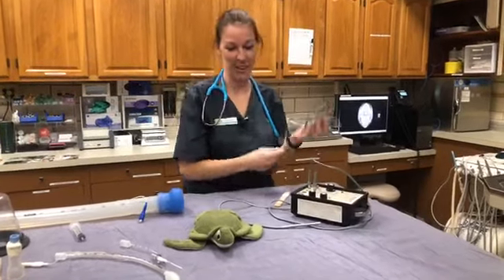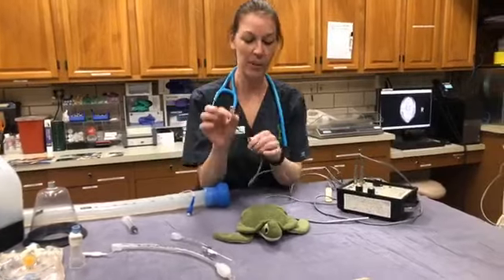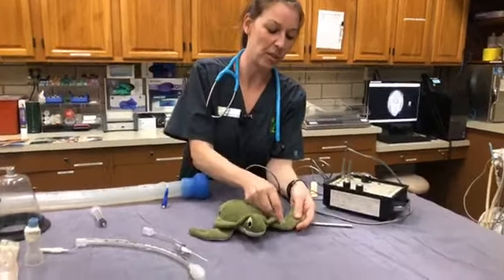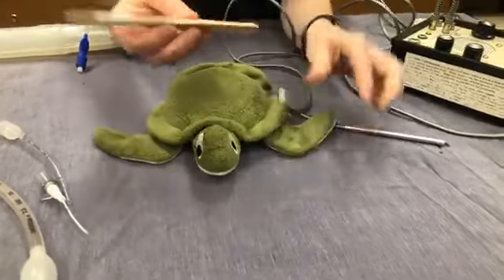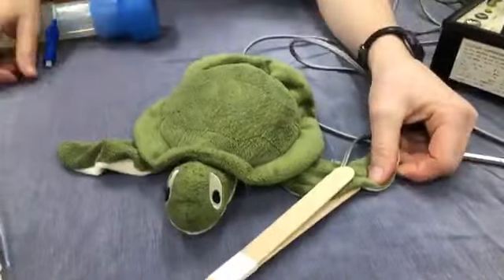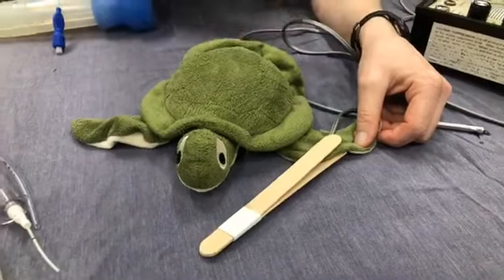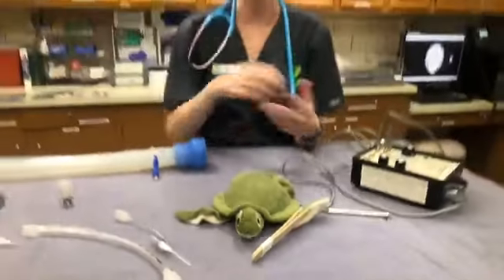Oh, and if you were doing a bird and you can't get your little pulse ox clip to work, we have a different Doppler probe that's a flat one, and you can put it over the artery in the ulna of the wing. Then we use tongue depressors with tape, and we just make a little clip that holds it in place. So you don't have to hold it there or check it every 10 seconds or so. You can just hold it in place like that. So, fun toys that we have here, ways that we work around things.